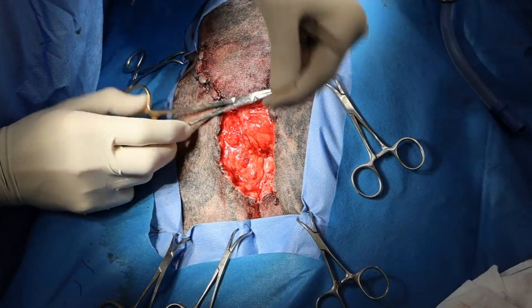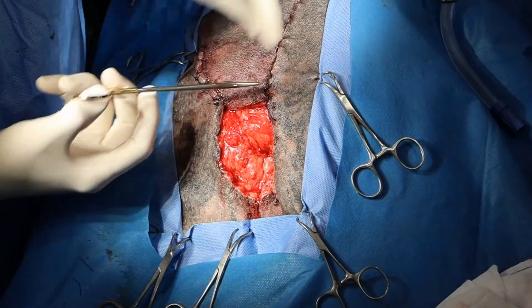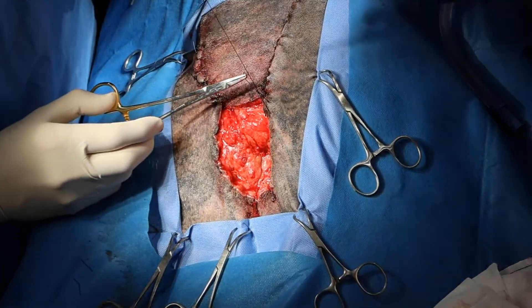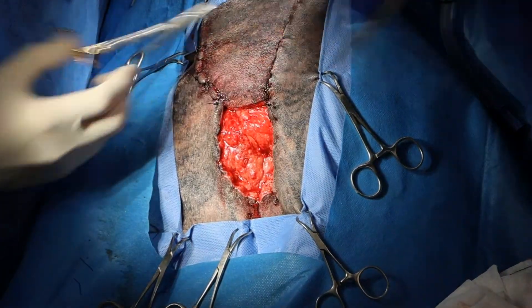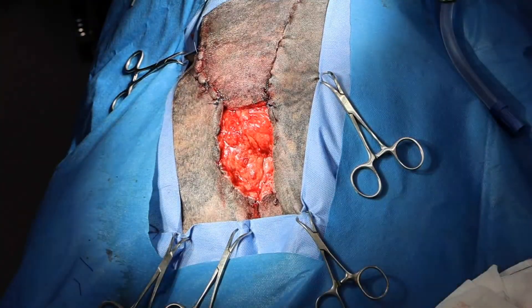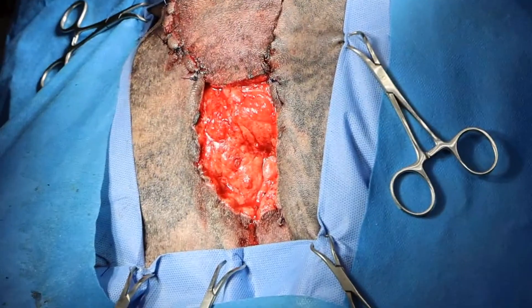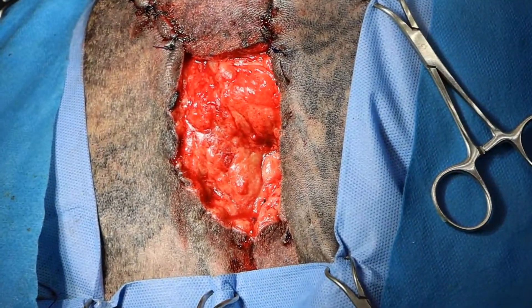Basically what we're doing is we're putting in loose loops that we can then thread sutures through. I'll zoom in a bit more so you can see what I'm doing a little bit more closely.